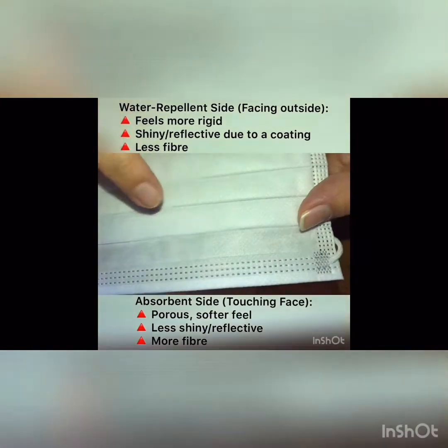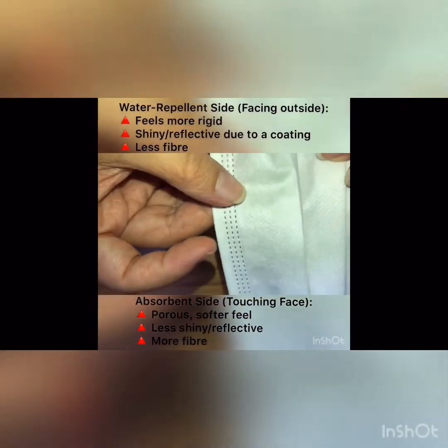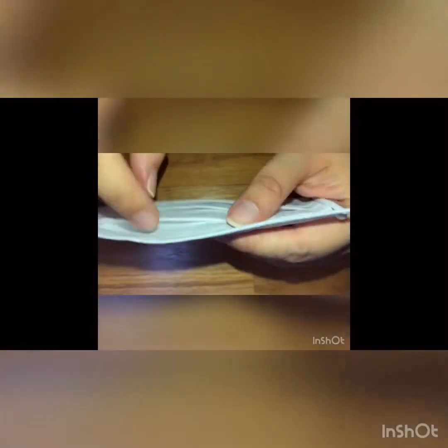The absorbent part would be slightly more cottony. I've checked this from the company's website — the correct way of wearing this mask is like this. This is the top part, this is the more reflective repellent side, and this is the more cottony side. As you can see, the repellent side is facing out, and the folds are pointing downwards.